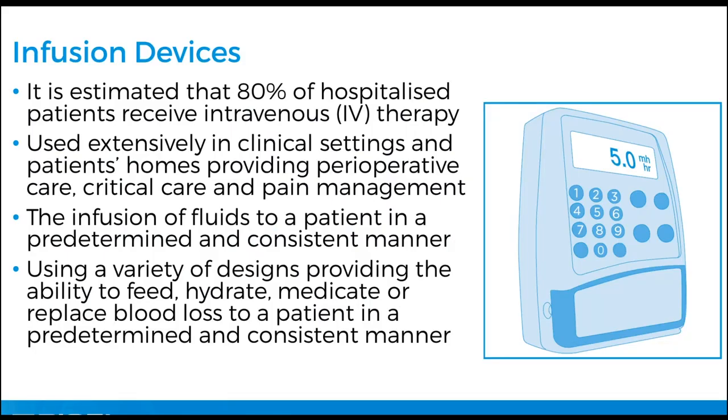So infusion devices. It is estimated that 80% of hospitalized patients receive intravenous therapy, used extensively in clinical settings, in patients' homes, providing perioperative care, critical care, and pain management. The infusion of fluids to patients in a predetermined and consistent manner, using a variety of designs, providing the ability to feed, hydrate, medicate, or replace blood loss to a patient in a predetermined and consistent manner. So really it's the predetermined and consistent manner that is pretty critical for infusion devices.